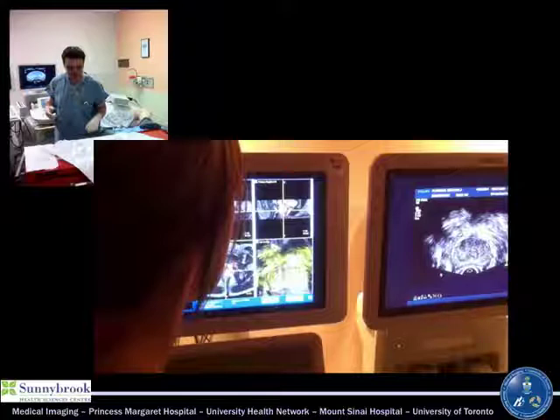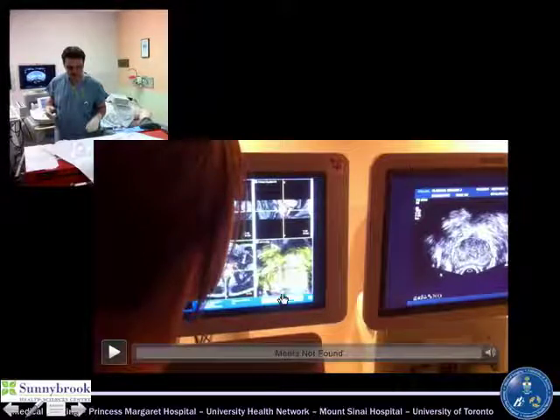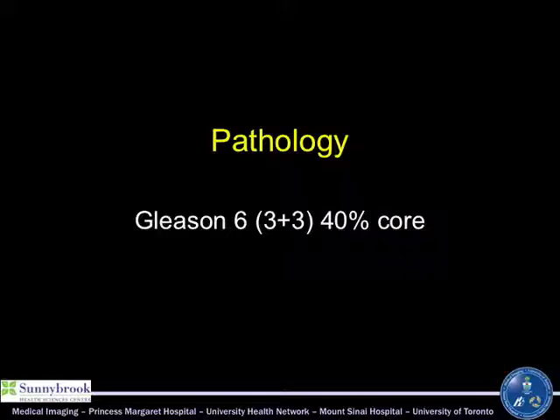This is Dr. Malo who does the biopsies. This is the other system that we're using and the one we currently favor because it's very fast. It takes about 3 to 4 minutes to get to a target. And this is a standard ultrasound image from a Philips IU-22, and this is the UroNav system. This is the one in use with the NIH. I don't know if this video will run. Probably won't. No, okay. But this is the MR fused on top of the ultrasound, and Laurent's able to hit these very, very quickly now. And I'll show you some of the results for those.